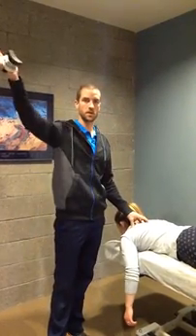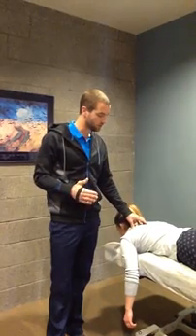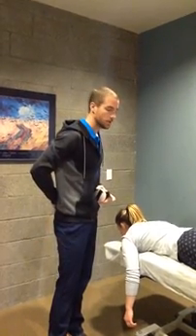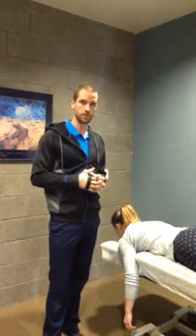So we've got mid-trap and low trap, as well as serratus as our main shoulder blade muscle test, scapular stabilizers, and then cuff-wise we're doing infra-teres, we're doing supraspinatus, we're doing subscap. And then basically you're averaging the 2, and you can correlate those to body weight and other things, but that's just how you perform the test for the upper quarter.